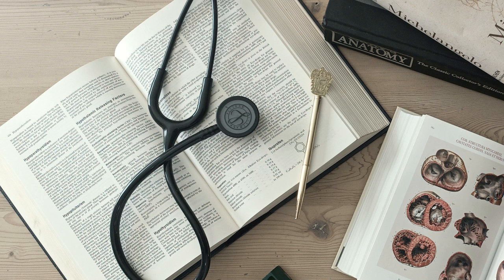Right. The golden rule for tachyarrhythmia analysis is the same as for ectopics, and it bears repeating because it's so important. Always, always look for small abnormal waves, P waves first, before allowing your eyes to be drawn to the large, often bizarre QRS complexes. P waves first, even in tachycardia. Especially in tachycardia. This disciplined approach will save you from misdiagnosis, like mistaking SVT with aberrancy for VT, and guide you to the correct anatomical origin.